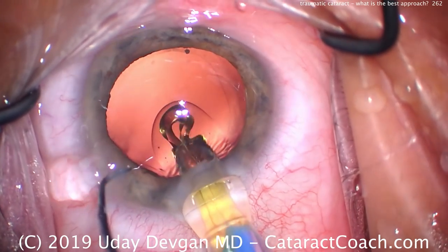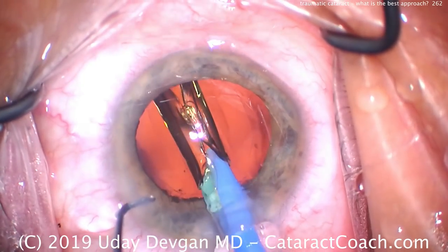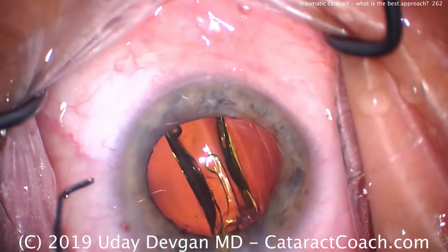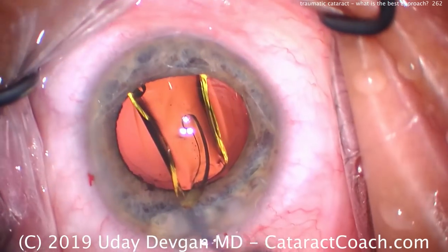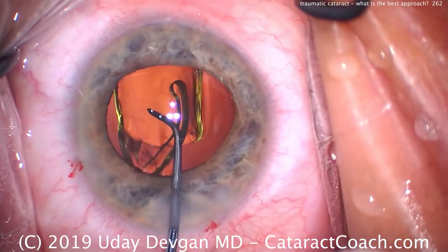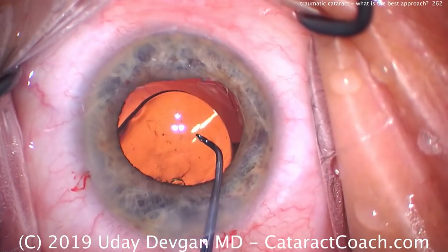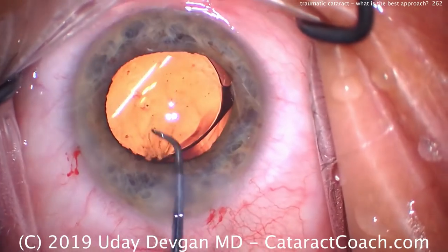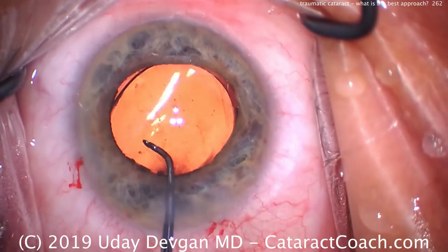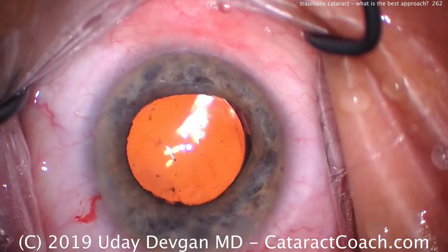Now, this patient had this trauma. His only side effect from this was the pupil was just a little irregular in normal settings. So in the clinic, on his appointments, his pupil was slightly ovoid and otherwise functioned normally. He had normal pupillary function. It constricted appropriately. So there's no need to even mess with that. We're just going to do our cataract surgery and leave the iris alone.